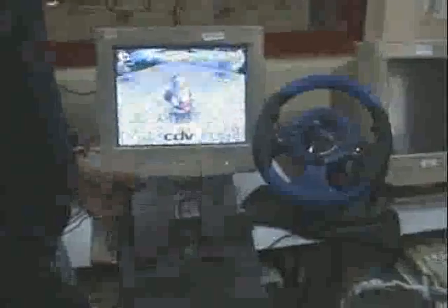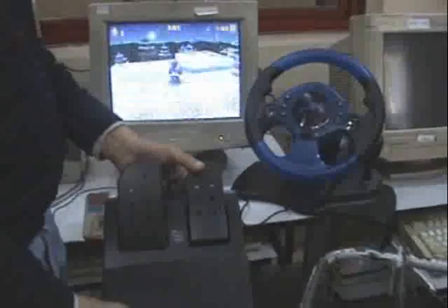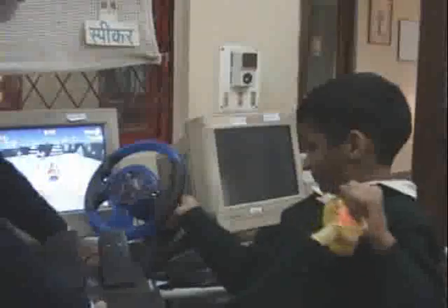So first we needed to see if this works for Arpit, and the best way that we could figure this out was to let Arpit demonstrate to us how he could play a simple children's game of Santa using the wheel. What Arpit is going to demonstrate to us is how, using the foot pedals, he can, in a game, move the Santa forwards and back, and using the gear shift, which is this button here, he can get Santa to jump.